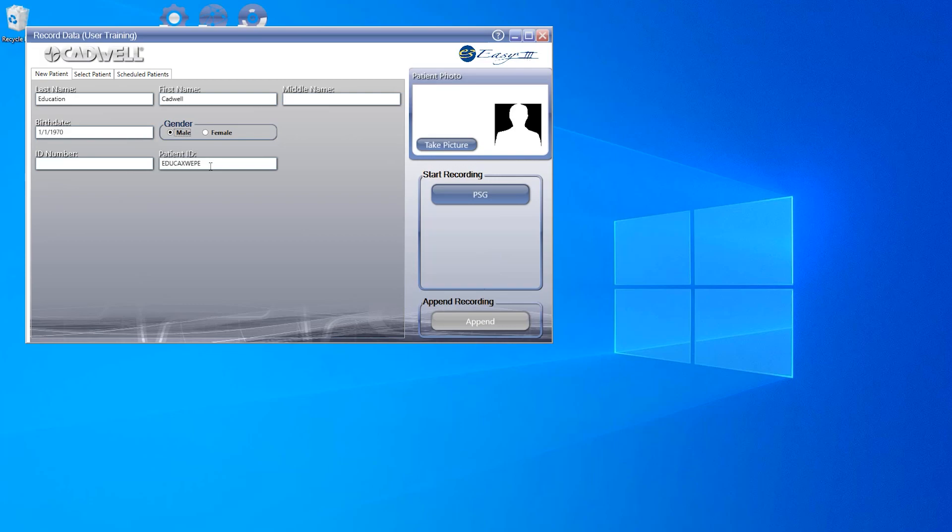You do not need to have patient information in the field forms to take a picture of your patient. You can take a picture any time before starting your recording. Once you've put in your patient information, your recording buttons will change from gray to blue, allowing the study recording button to be selected. In our case, we are using the PSG button.